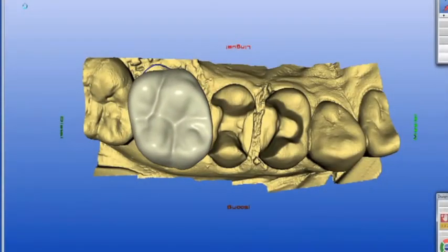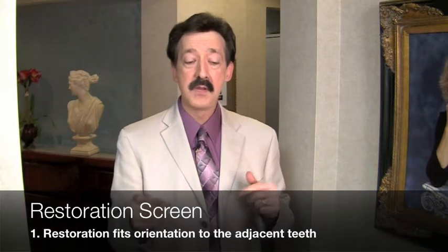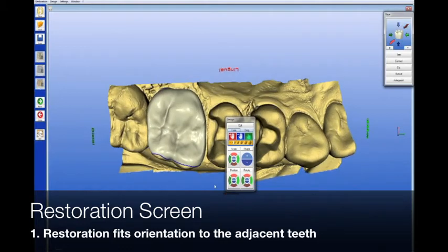That's when the biogeneric takes over — it gives me that proposal. Now I'm in what I call the restoration screen. There are three steps I accomplish here. Number one, particularly if it's a full crown, I make sure the full crown fits the proper orientation to the quadrant. If it's a partial coverage restoration, it's usually just positioned right. If it's a full crown, I want to make sure my curve of Spee and curve of Wilson is correct so the cusp fits the arch. In most cases, if you've taken the optical impression at the right angle, it all works.